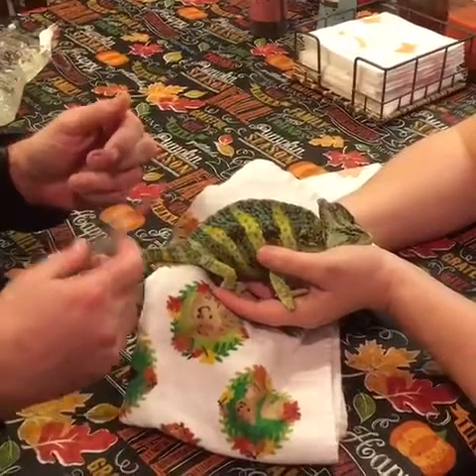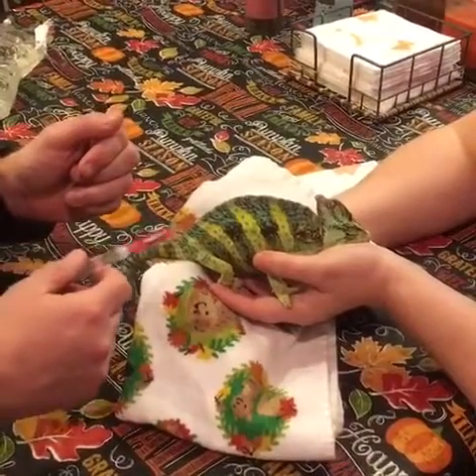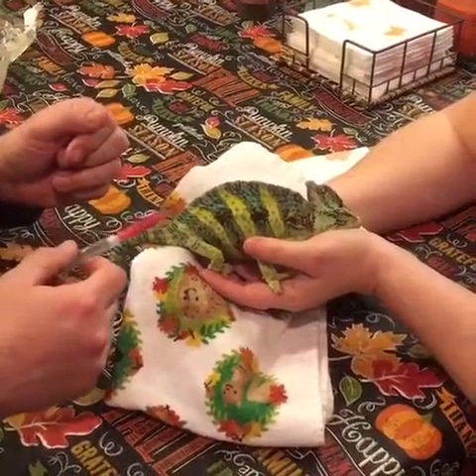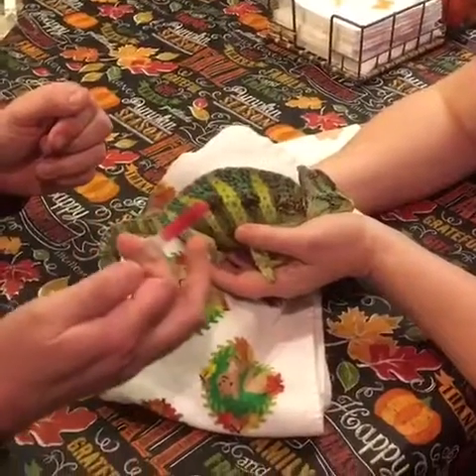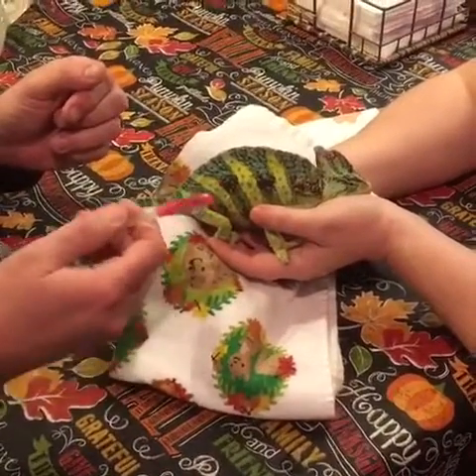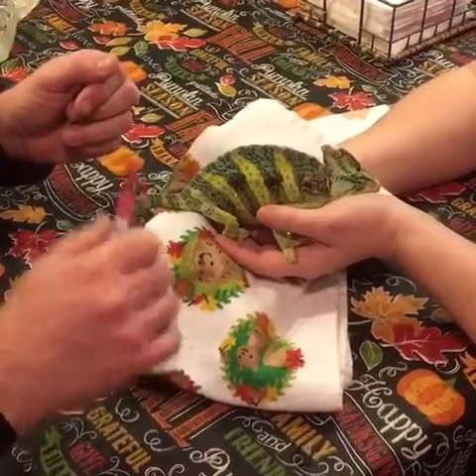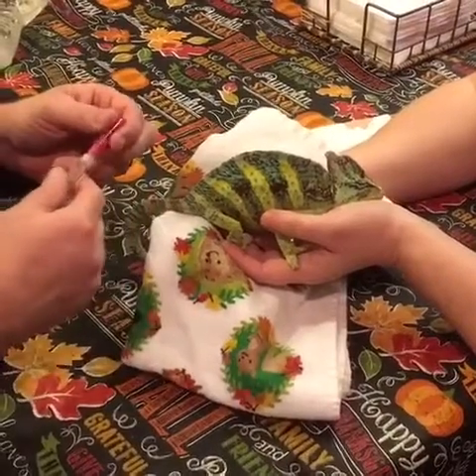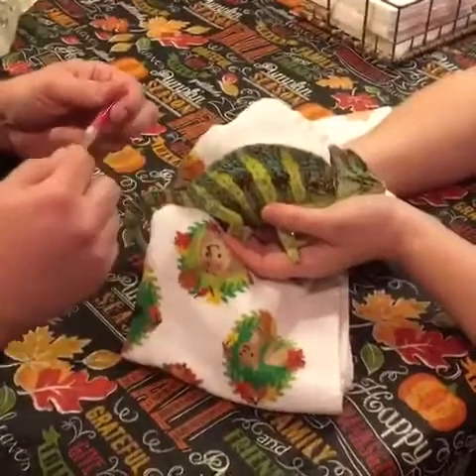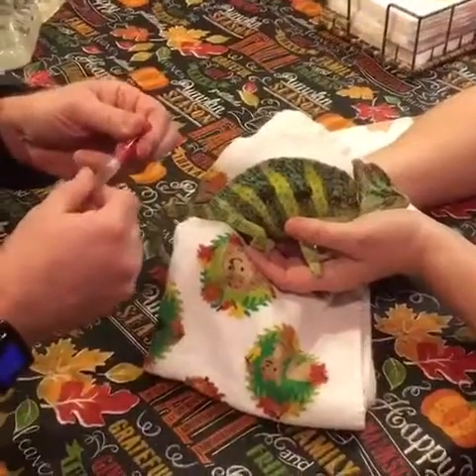This is Rango, who has a tumor on his side. We give him sub-q fluids every few days using a 25 gauge needle and sterile saline solution. We heat up a dish towel in the microwave for about 15-20 seconds to give him something warm to sit on, and we also heat up the sub-q fluids by running them under warm water.